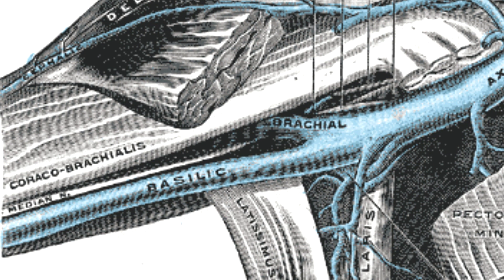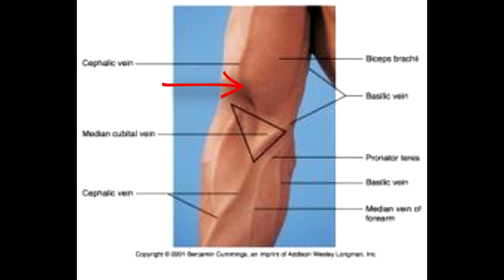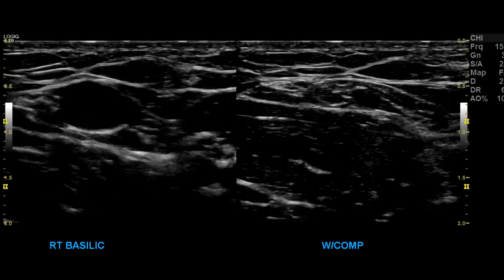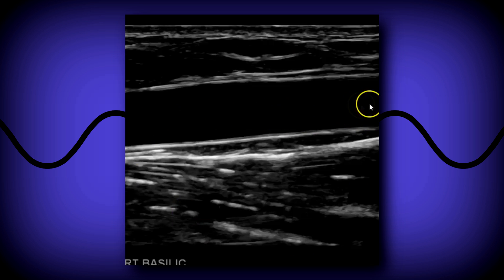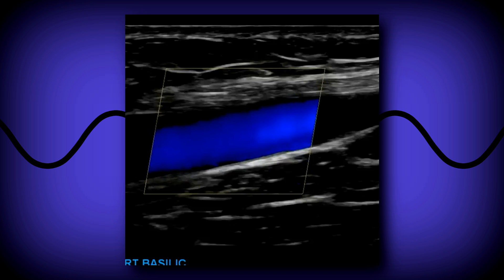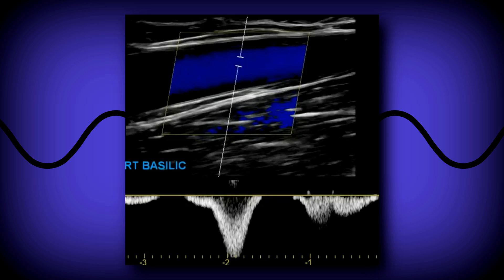Next we do the basilic vein. The basilic is superficial and usually on the medial part of the arm. The cephalic vein runs on top of the bicep, while the basilic is medial and usually very close to the brachial artery and veins. At that level, do a dual-screen showing the open vessel — which will be much bigger than the brachial veins — and then collapsed on the second screen. Then a longitudinal grayscale view with no internal echoes, using TGCs, then color Doppler, and spectral waveform with augmentation.